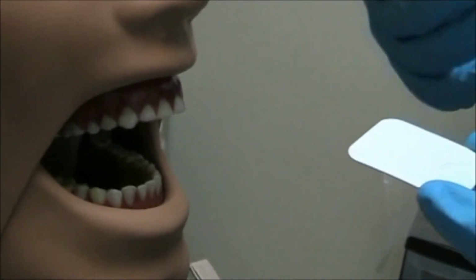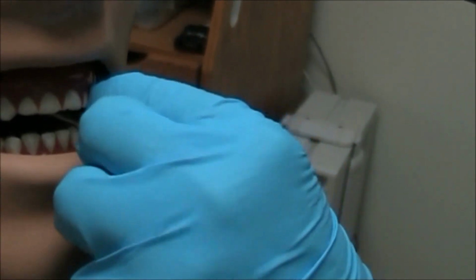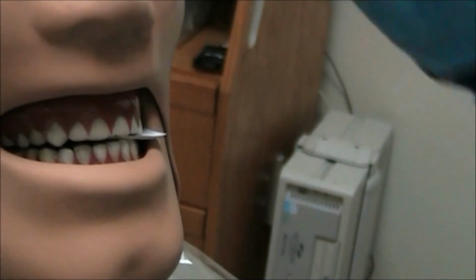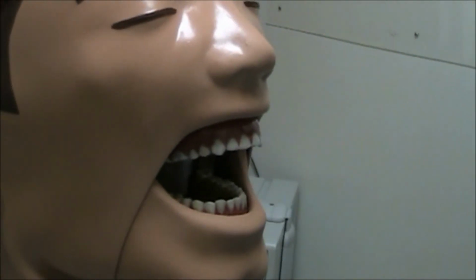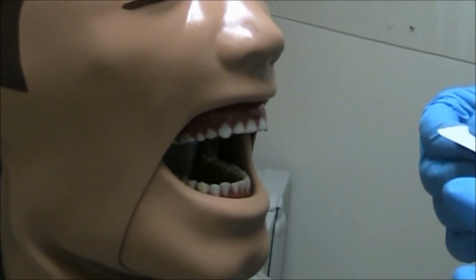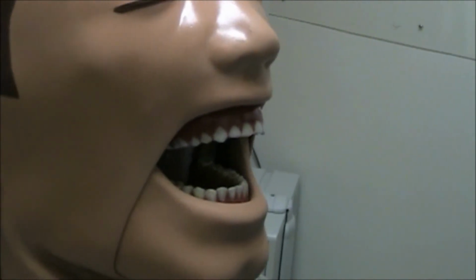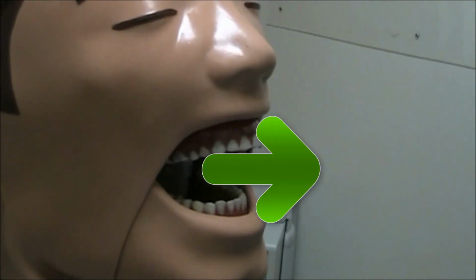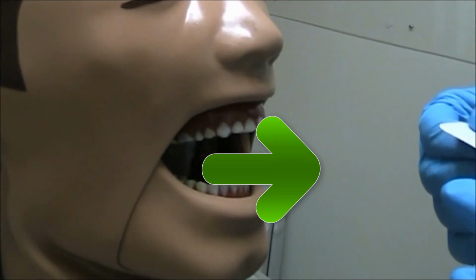When exposing maxillary lateral occlusal projections, the patient position should remain the same as with the topographic occlusal projections. Again, in our clinic, we are using size 2 receptor with the flat side of the receptor facing the maxilla and the long edge in the front to back direction. And we want to shift the receptor to the side of the area of interest. So for example, if we are trying to expose the right side, we will shift the receptor towards the right side. And if we are trying to expose the left side, we will shift the receptor towards the left side.